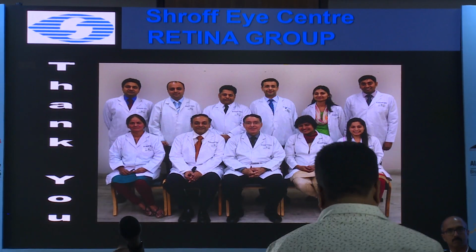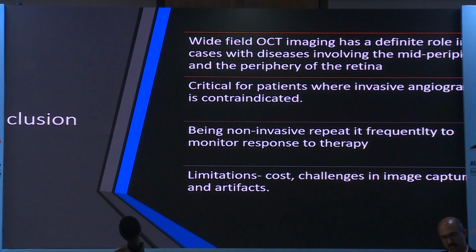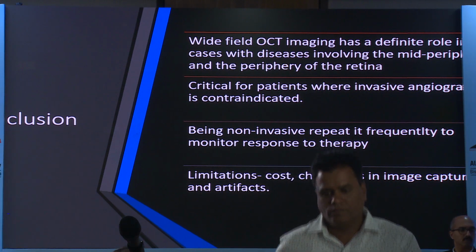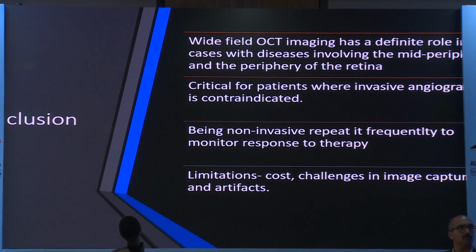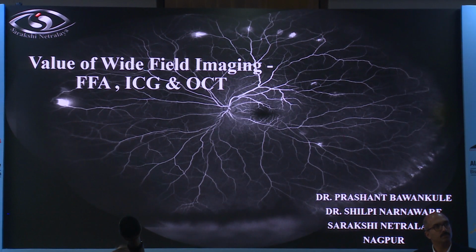Thank you, Daraius. Before Prashant, the next speaker, puts the slides on, with both OCT and OCTA, do you think one day we'll give up all the angiography, the regular ICG and FFA? I think maybe one day, but not yet, because you cannot see the leakage. That's the main problem. You can see the flow, but you can't really see leakage using this technique. So that's the limitation. And certain other things where I feel ICG is very useful: of course we don't have the dye now, but for pre-PDT, I don't think we can depend only on OCT for that. So these are the conditions.